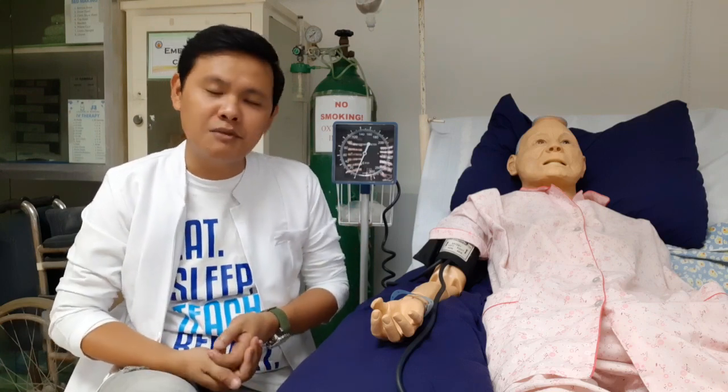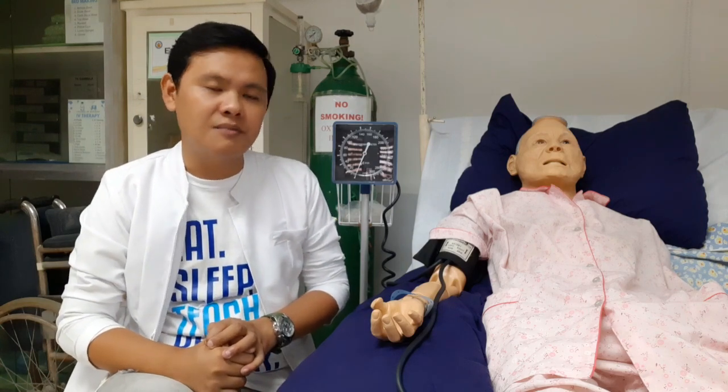So first of all, we need to assess our client for any clinical manifestations, signs and symptoms ng hypotension or kaya naman hypertension. Na-discuss ko naman sa inyo to during our lecture, ano yung mga clinical manifestations na makikita natin if a person is suffering from hypotension or hypertension. Ano pa? What are the factors that may affect the blood pressure? Okay, na-discuss ko na rin naman sa inyo ito in our lecture, so hindi ko na ito i-identify pa. Because there are different factors that may contribute in the blood pressure of our client, such as the environment, the medications, the stress, etc. Okay?